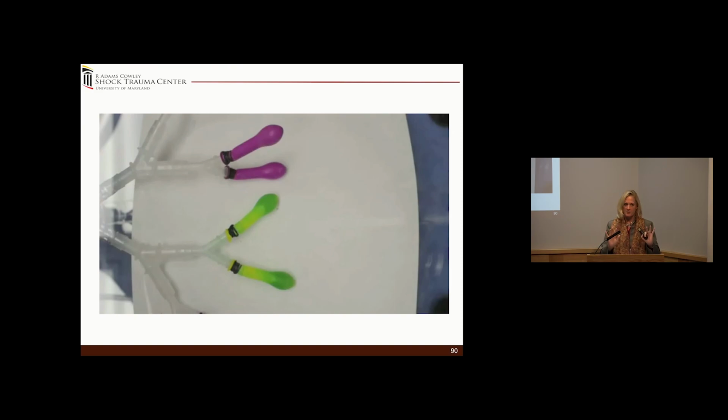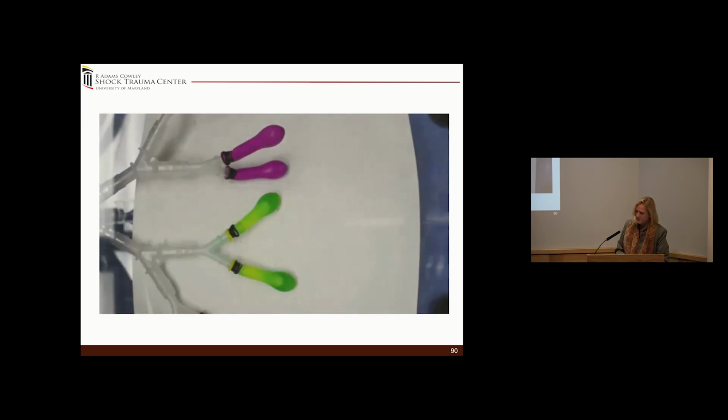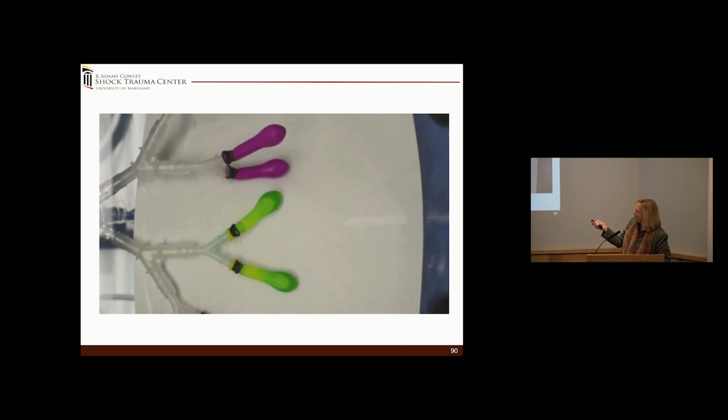No difference in airway pressure, no difference in rates, all right? But what you're going to see is this is the pressure control, and you can watch here that, maybe, okay, you can see the little vibration here, and you can see the gum kind of moving down a little bit, but it's all still stuck there, okay? This is the pressure control 1-to-1.